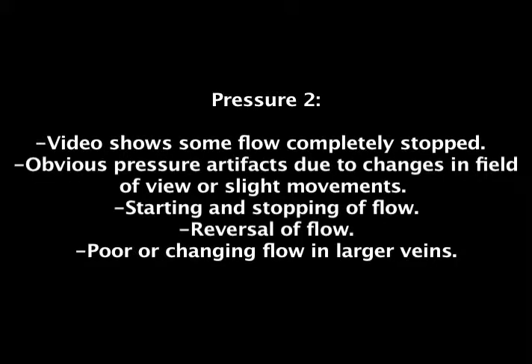This time we'll start with the worst videos that were scored as a 2. Videos will get a score of 2 if they show some flow completely stopped, obvious pressure artifacts due to changes in field of view or slight movements, starting and stopping of flow, reversal of flow, or poor or changing flow in the larger veins. Here are some examples of unacceptable pressure.